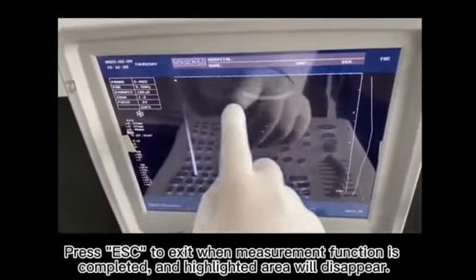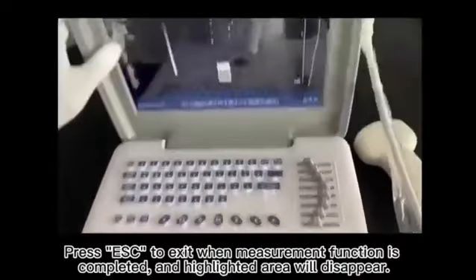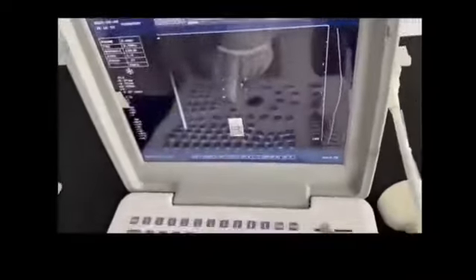Press ESC to exit when the measurement function is completed, and the highlighted area will disappear. Press the Clear key to clear the data on the image.